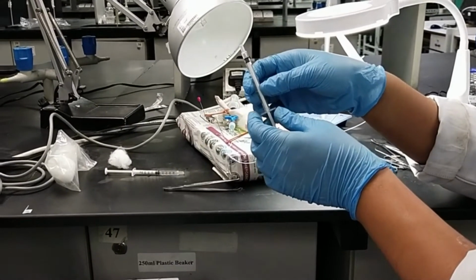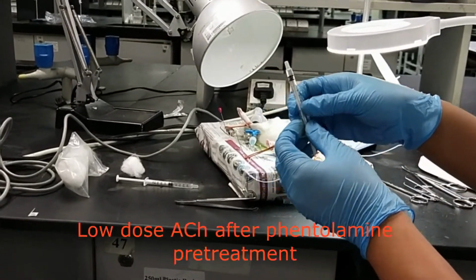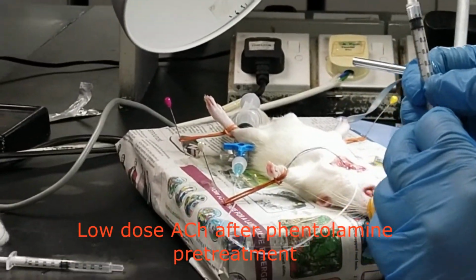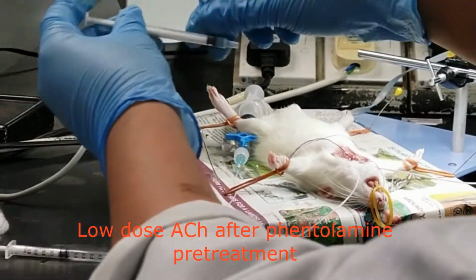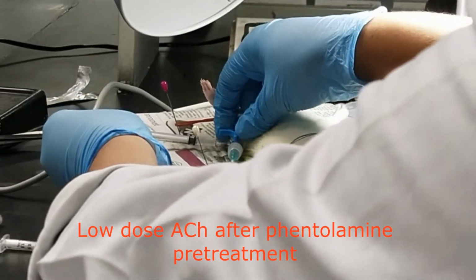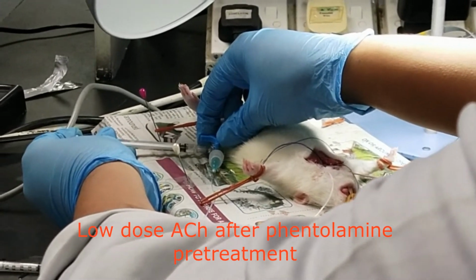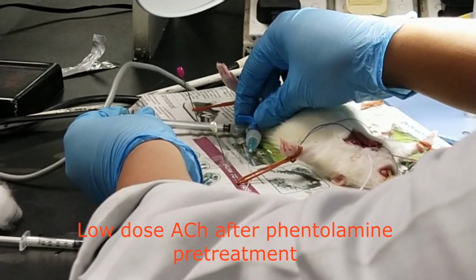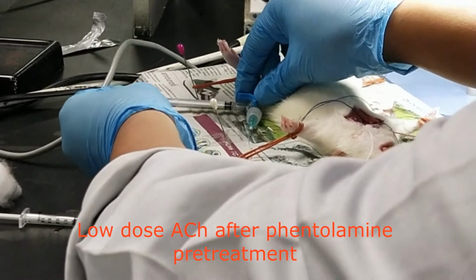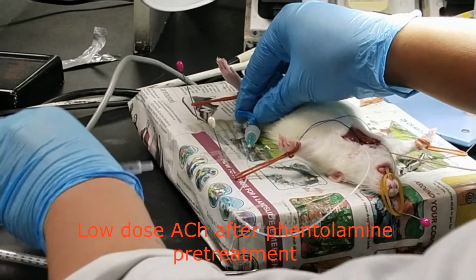So now we're going to proceed with the post-treatment by using the acetylcholine. So we're going to use the low dose acetylcholine, 0.5 microgram per kg. So we're going to inject the acetylcholine into the system to see the effect of acetylcholine after the pre-treatment by using the phentolamine. Okay. And then we're going to proceed with 0.5 ml of normal saline as well.